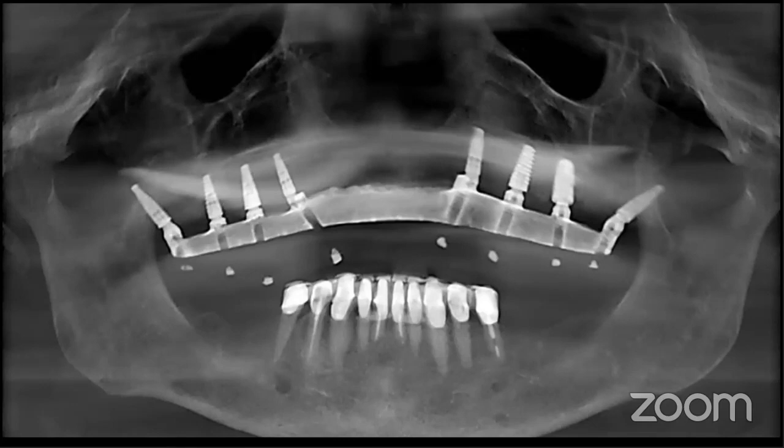So as we're placing these implants, in order to increase our composite torque value, we add some pterygoid implants. And by placing these pterygoid implants, we're engaging very dense, hard type 1 bone, and is increasing our CTV, which is also going to eliminate cantilevers. So it's going to do nothing but benefits for us in terms of placing this restoration.